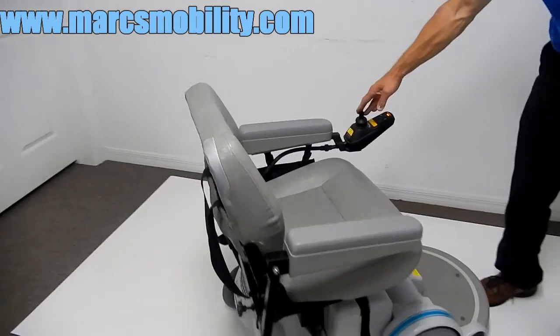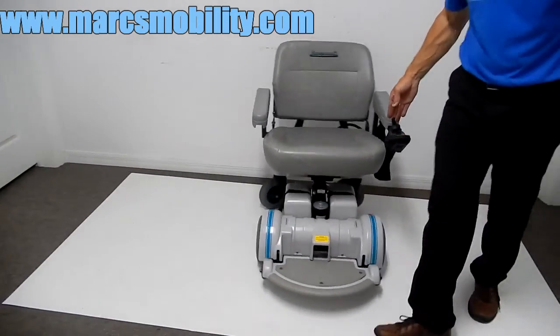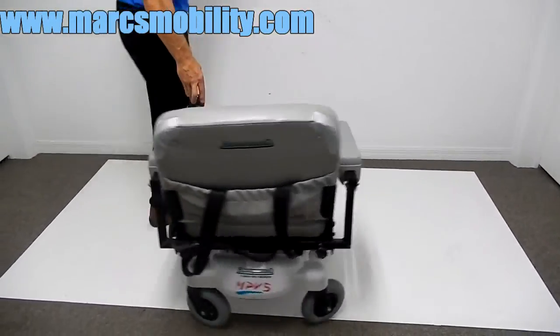If you want to know what the turning radius on your chair is — if you're in the house, this is what you'll need to turn the chair. The chair turns pretty well.